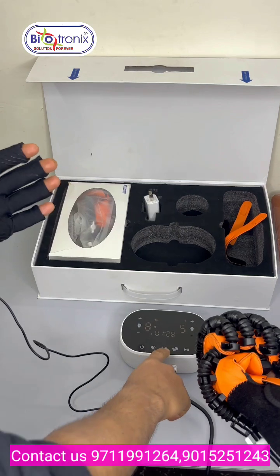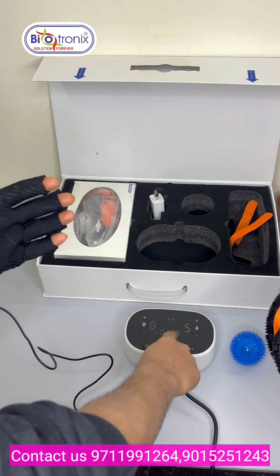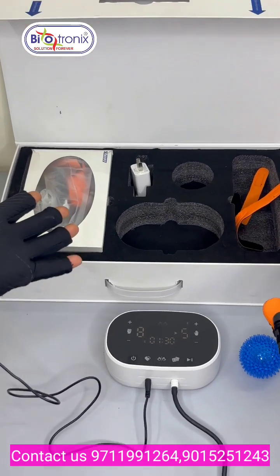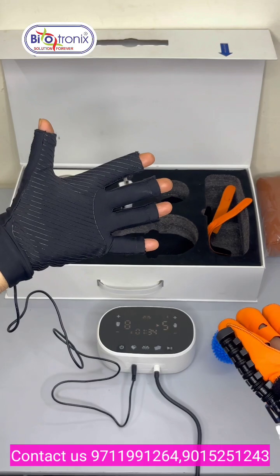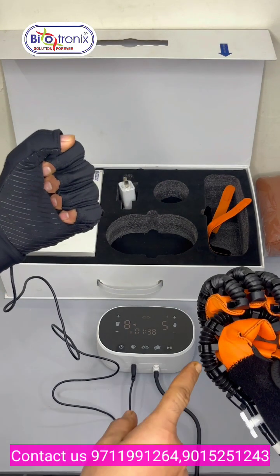So now I am switching the same to the mirror training mode. Now I will start the same, and you can see the data glove currently is extended. Now I am flexing the same. So you can see the rehabilitation glove is also flexing.